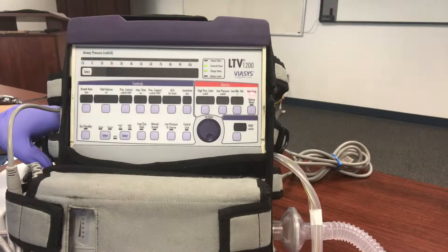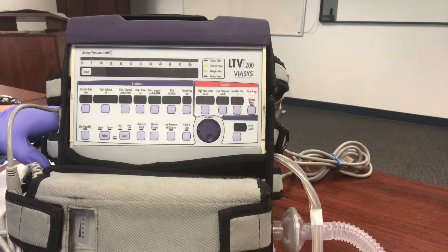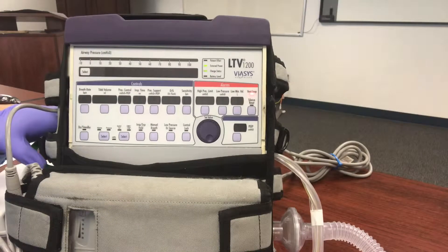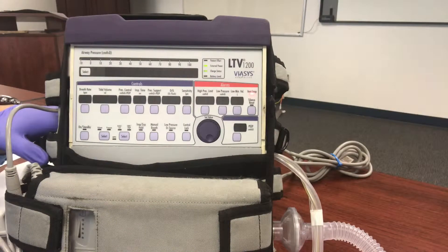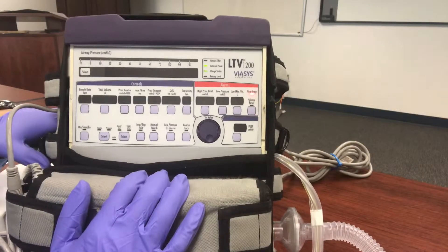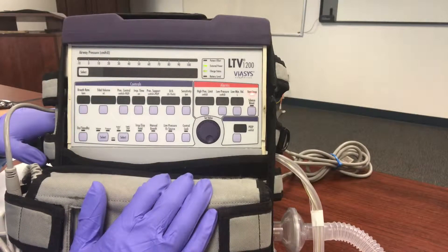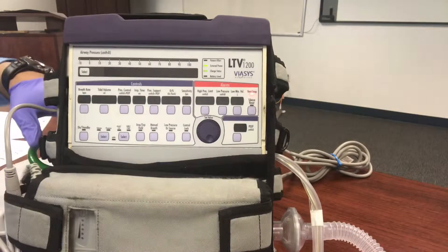We have our LTV 1200 travel ventilator and we're going to use this as a BiPAP. It's important to know these are not made for that. They're not very user-friendly, they're not very comfortable as a BiPAP, but I'm going to show you a couple of things that will make it more comfortable for your patient.